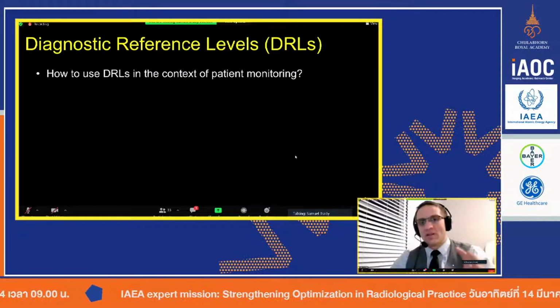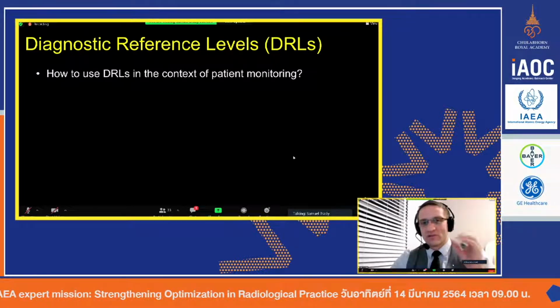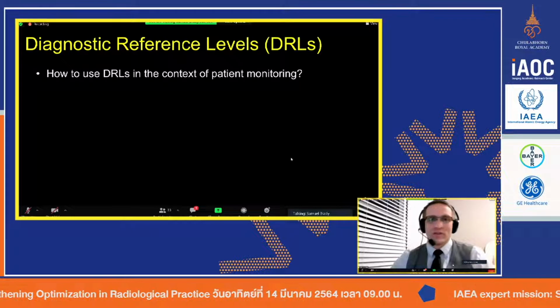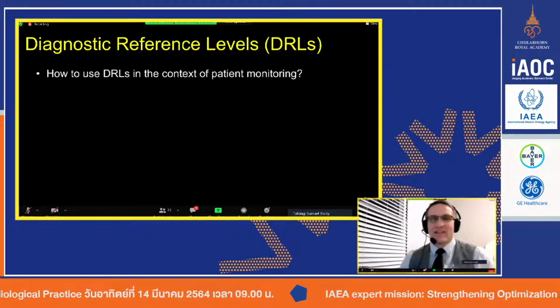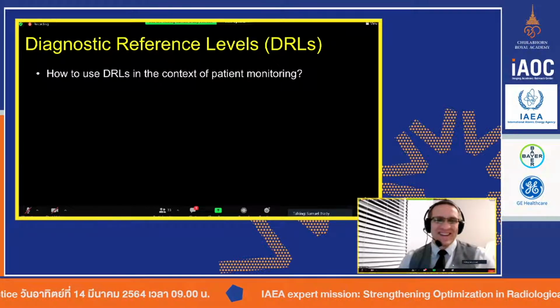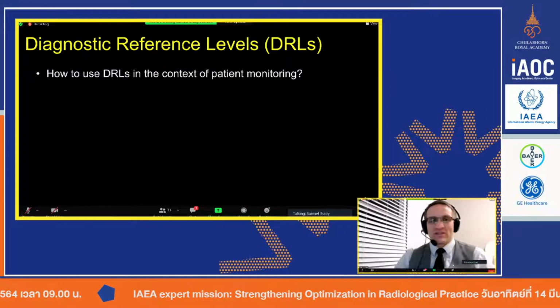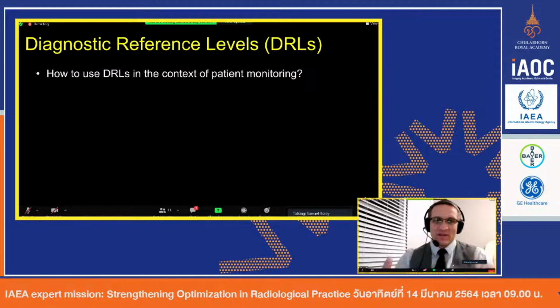And so we constantly need to take that new technology that comes out, and constantly invest in it. And so if you're using a CT scanner, which I don't even know if you can, but if you're using a CT scanner that's 15, 20 years old, you're not doing a service to your patients. You really do need to do your best to try to keep the newer technology.